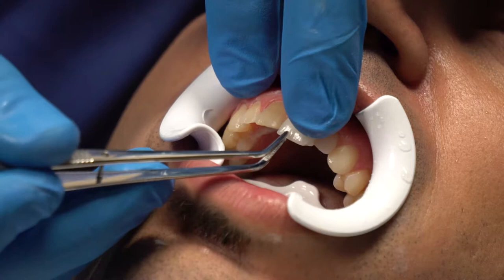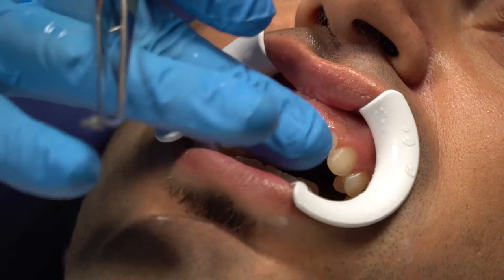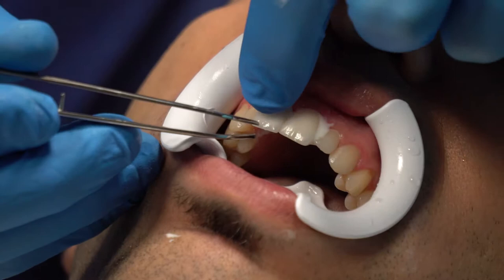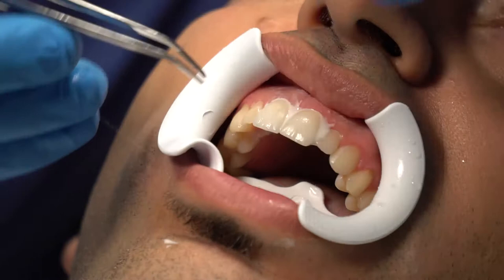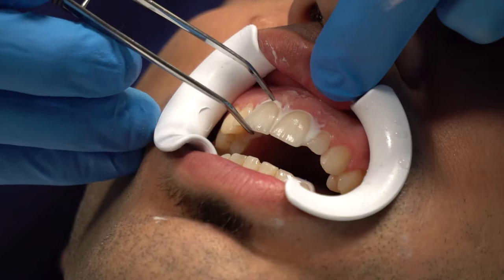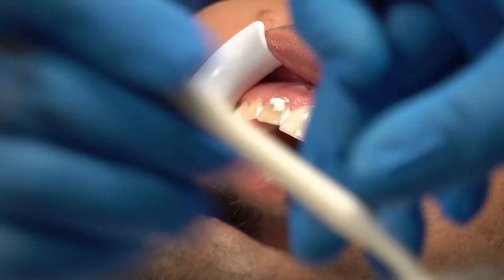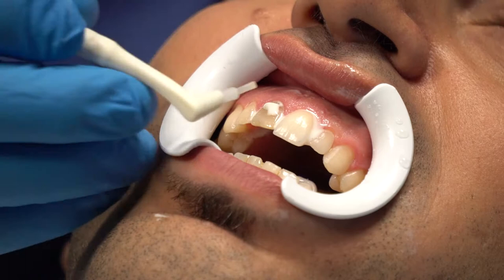I was thinking about using some pink, because as you just witnessed, when we use the TetraPake enamel it just whites everything out — and sometimes you want that. A little bit better, but maybe just a smidge more. If I paint this really thick it was too white, so I'm going to paint this thinner.